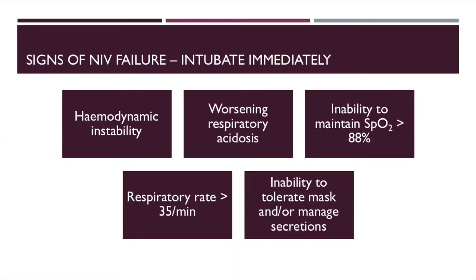These are the signs of NIV failure. If your patient shows any of these signs, stop the NIV and intubate the patient immediately. Do not delay intubation in these cases, as this causes a worse outcome and has been shown to increase mortality.